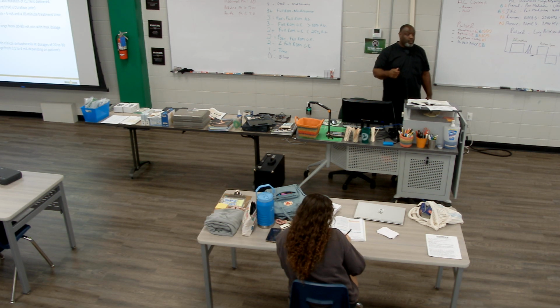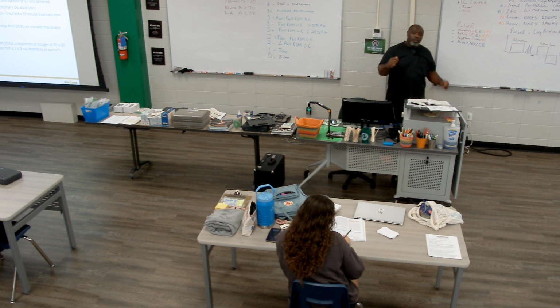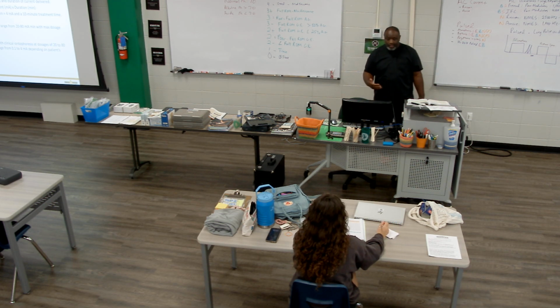When you go to the pharmacy, they say take 2 milliliters, take 5 tablespoons, take 1 teaspoon of this. That's a dosage. Iontophoresis is treated just like that.